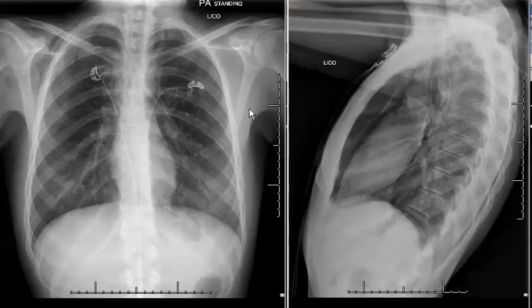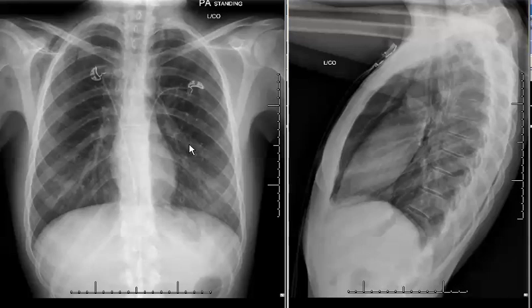These are PA and lateral radiographs of the chest of an 18-year-old female presenting with retching chest pain. Looking at the radiographs themselves, we don't see any obvious abnormality, but on more careful inspection, we do see some foci of air outlining the aortic arch right here.